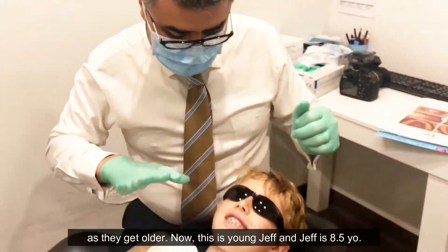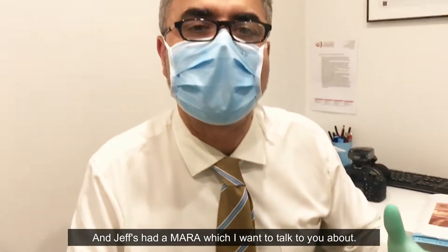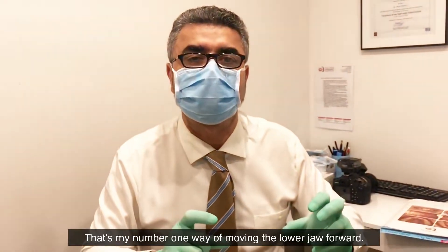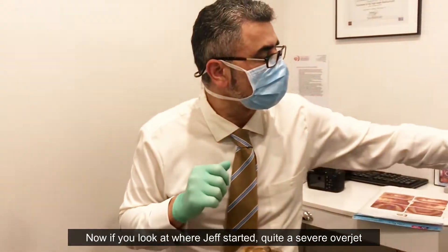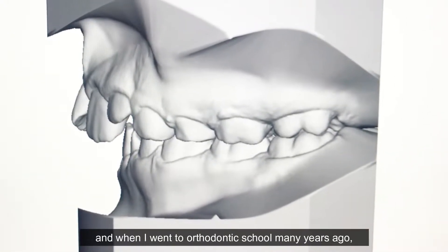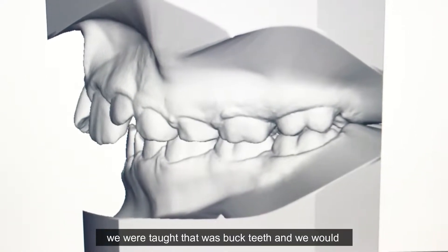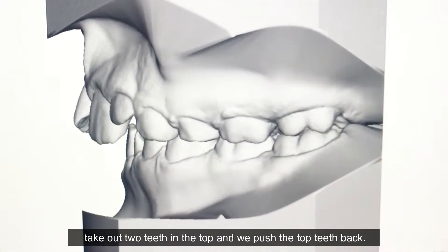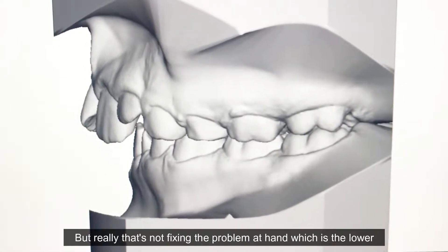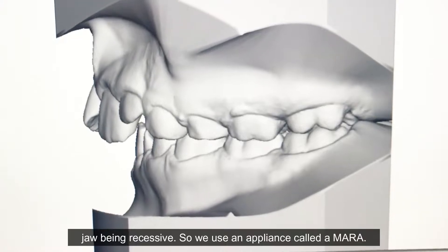This is young Jeff, and Jeff is eight and a half years old. Jeff's had a MARA, which I want to talk to you about — that's my number one way of moving the lower jaw forward. If you look at where Jeff started, he had quite a severe overjet. When I went to orthodontic school many years ago, we were taught that was buck teeth, and we would take out two teeth in the top and push the top teeth back. But really that's not fixing the problem, which is the lower jaw being recessive.